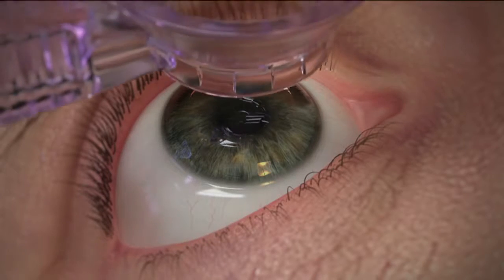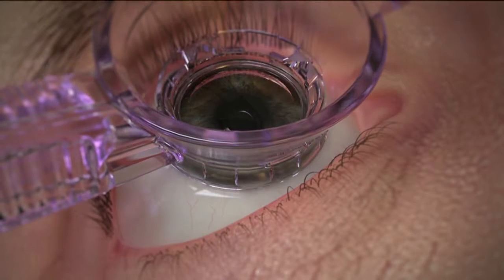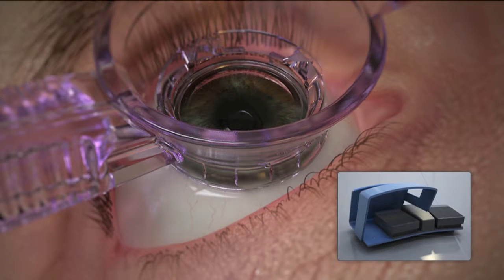Once the patient is in place, the physician lays a suction ring gently onto the surface of the eye. The physician then steps on a foot pedal to activate a precisely controlled suction system to adhere the ring to the eye.